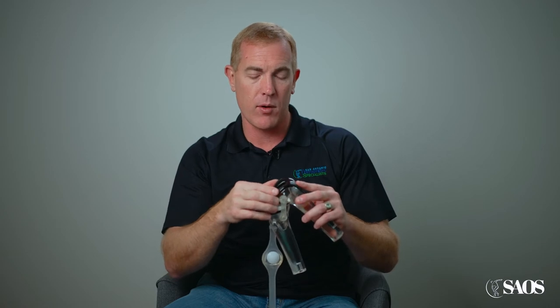Well, our natural knee is not perfectly round — on one side of the knee it may have a larger curvature than the other.